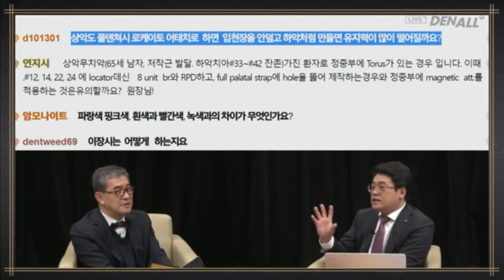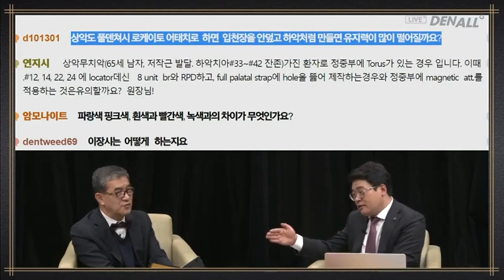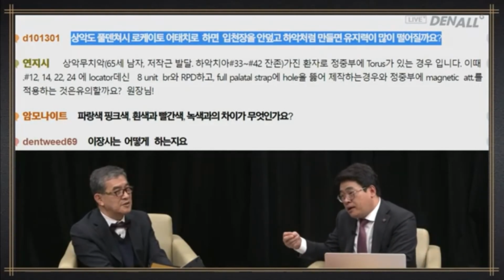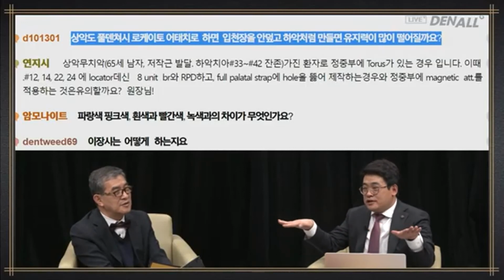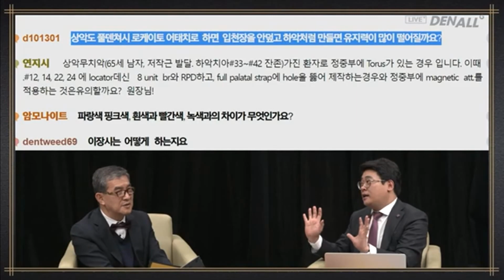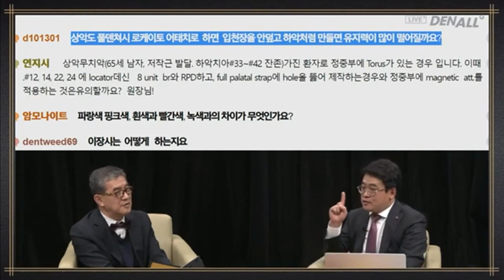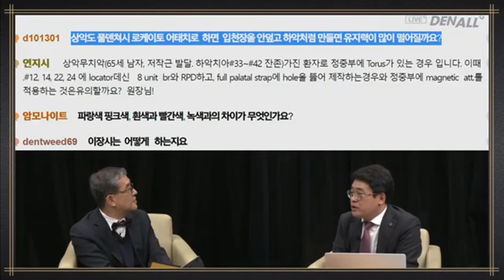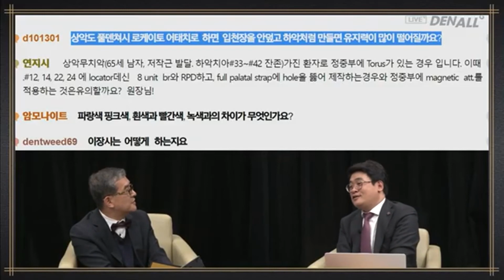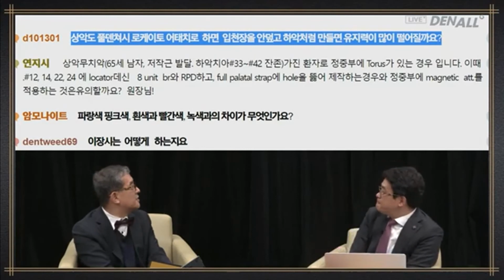And there are different types of the palate. The people with deep palatal vault, we can use AP palatal strap type. And if it is flat, there is no horizontal stability. So if possible, you need to cover the palate to disperse the occlusal force. In the upper, palate is where it occurs most efficiently. If you punch it out just because the patient complains of discomfort, you don't know what's going to happen. Therefore, I recommend covering it.